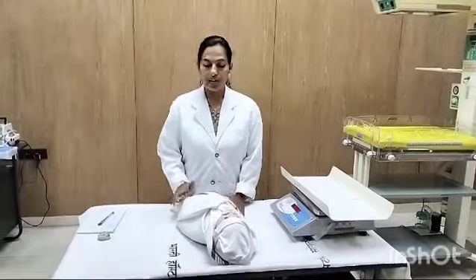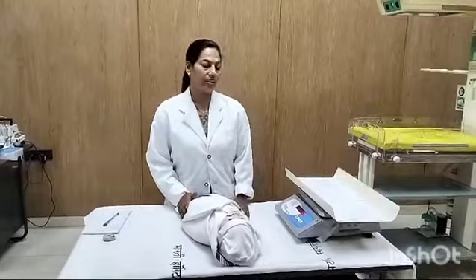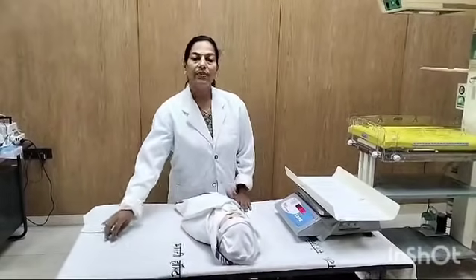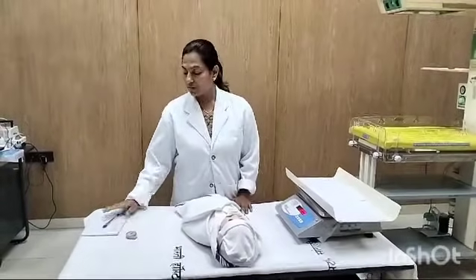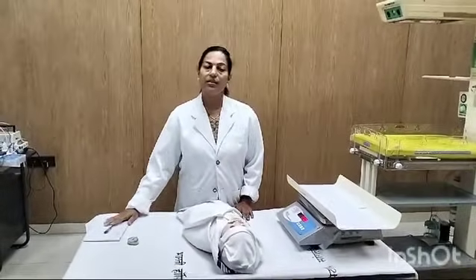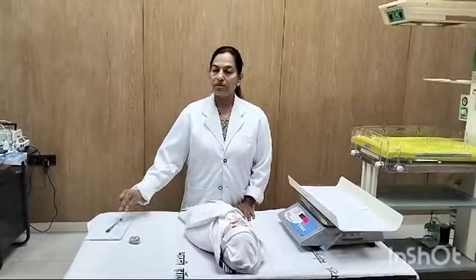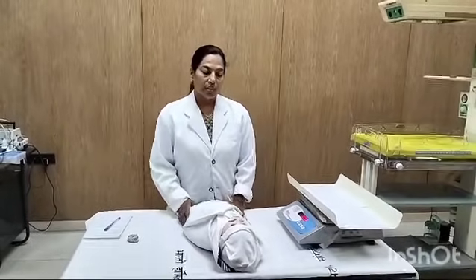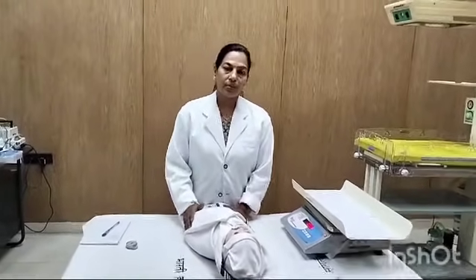So for this procedure we need a weighing machine, a measuring tape, and a notebook and pen to mark the measurements. We will now start the procedure.